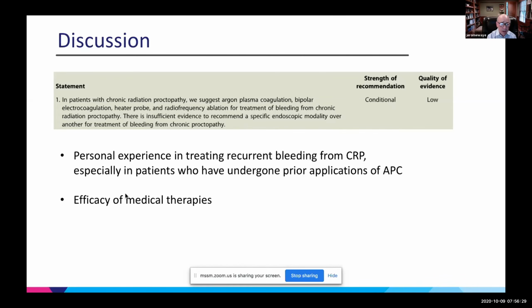So I cautiously looked inside, and actually there was nothing, there was no damage inside. Fortunately, I was only in an inch or two, and the explosion caused the scope to be blown out of the rectum instead of blowing up the rectum itself. So I was really invited over to Cornell University, to Cornell Hospital, to speak before the radiation oncologists, because they wanted to see what this new therapy was. And actually, we did very well and put the treatment of APC on the map.